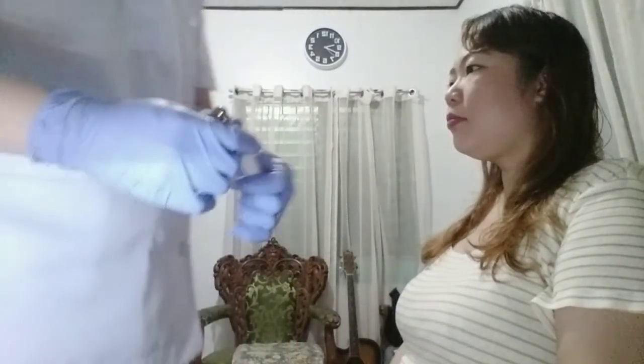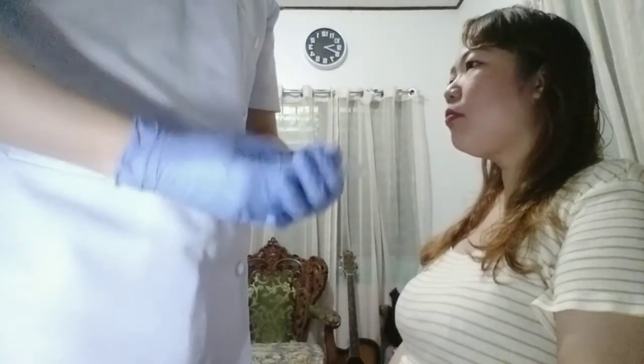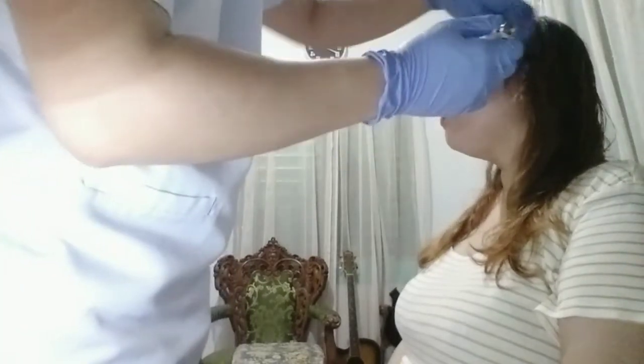So next, I'm going to inspect the auditory canal using an otoscope. But since we don't have an otoscope, I'm going to use the pen light instead. So in here, I'm going to check for the cerumen, also known as the earwax, the appearance, and tenderness. So I'm going to check now the earwax or the cerumen.